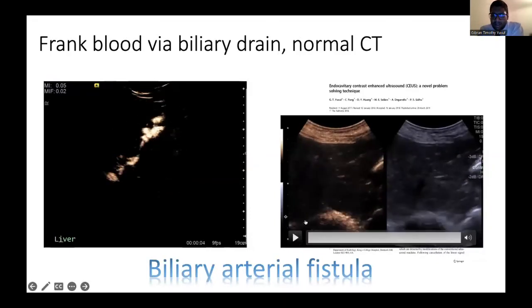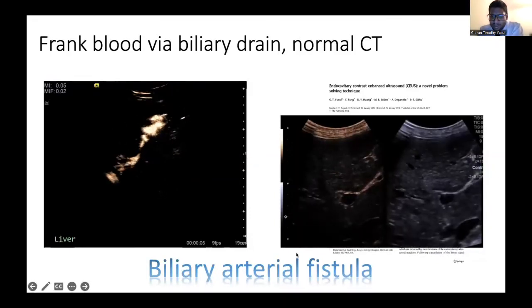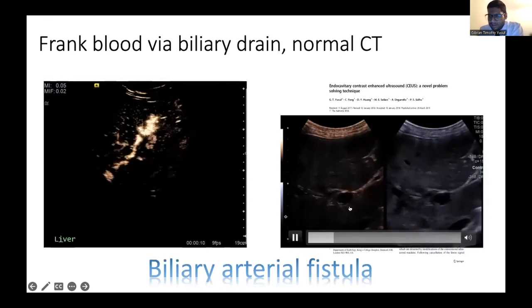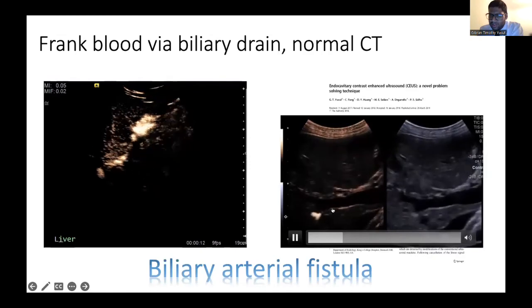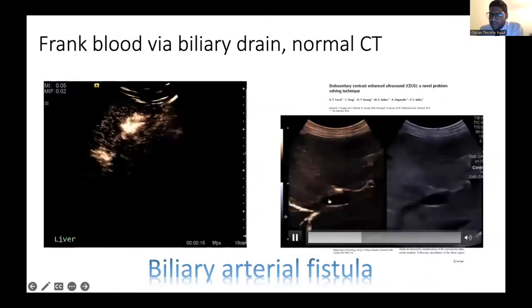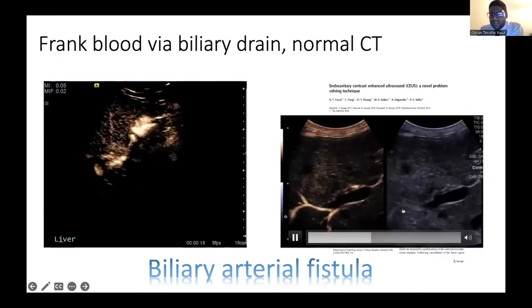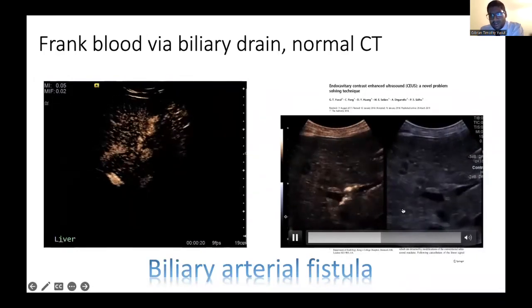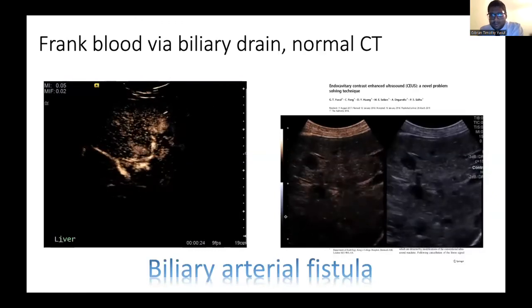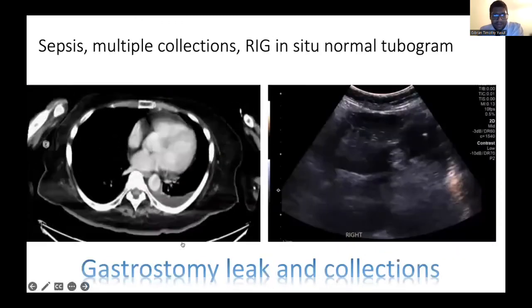Compared to the other video, where you can see just the biliary ducts lighting up. Very late, you can see 1 or 2 extravasation of bubbles where it has reflux into the portal vein, but you can see just the biliary ducts. And this is as good as a cholangiogram. Indeed, you start to think about possibilities with things like 3D imaging.